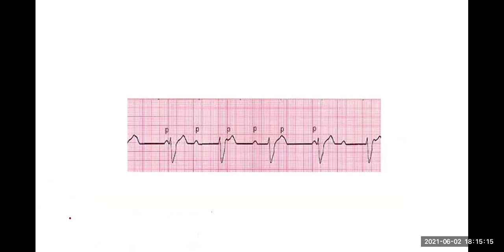So coming back to third degree block. What is the definition of third degree block? None of the P waves go. So what happens then?